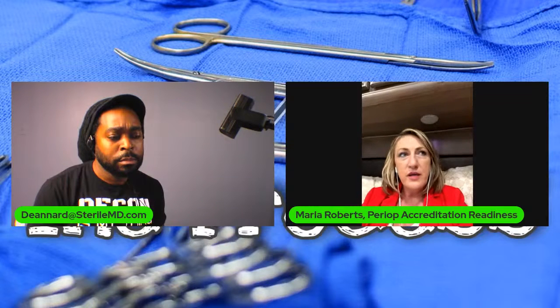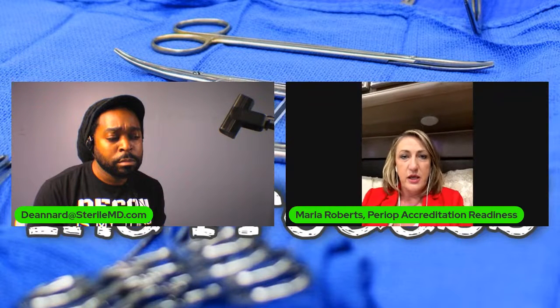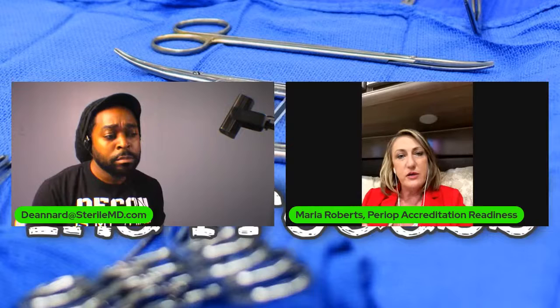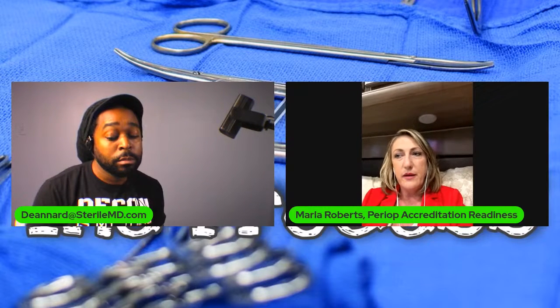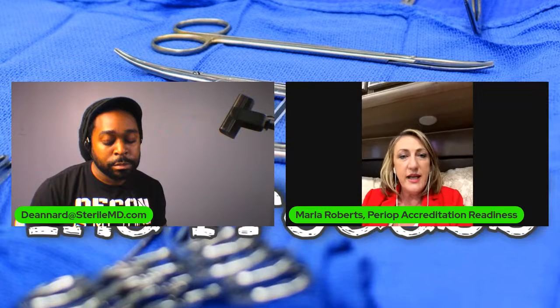With COVID, and it has so many variants and everything else that's going around, now they're looking at, should the same solution be used for the same patient? Each patient tray, you will ask people, when do you change your ultrasonic cleaner? And they'll say, when it's visibly dirty or soiled. And no, really, it should be changed after every patient case that you're doing. The same thing with high-level disinfection that's around, Cidex now. It's good for 14 days.